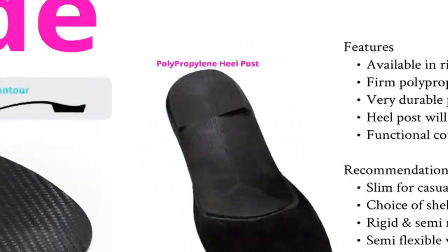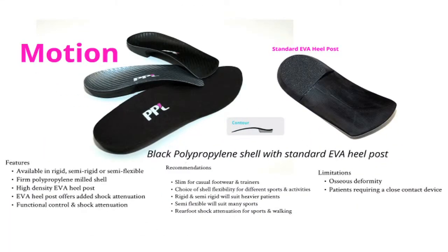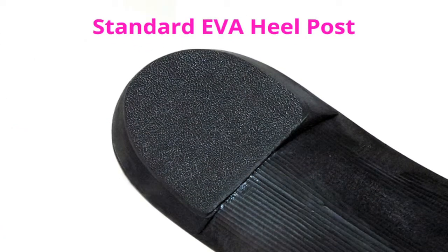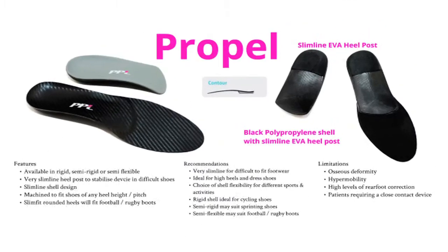Motion is a black polypropylene shell with an EVA heel post which will give the polypropylene greater shock attenuation. Here is a close up of the EVA heel post — you can see how the heel post is incorporated onto the device. Our Propel device is also black polypropylene with a slimline EVA heel post, which will aid those patients who have accommodation difficulties with their footwear.